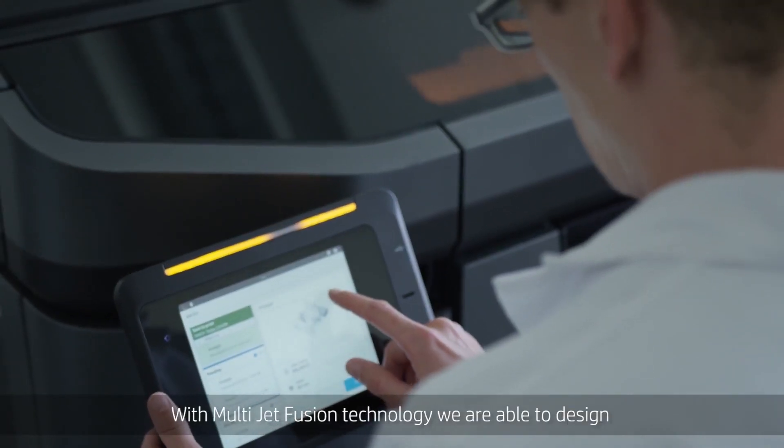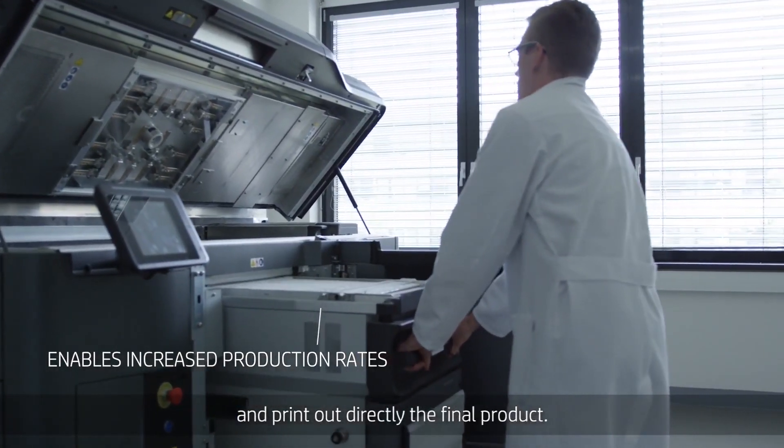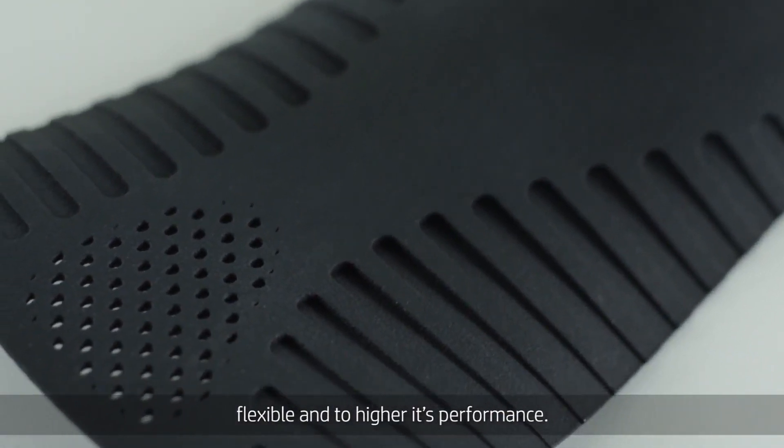With multi jet fusion technology, we are able to design and print out directly the final product to make the product lighter, more comfortable, flexible, and to heighten its performance.